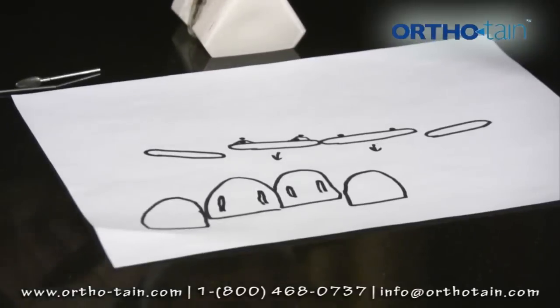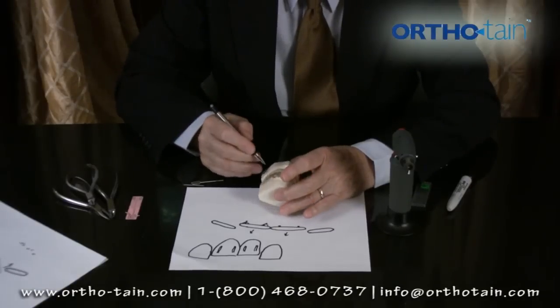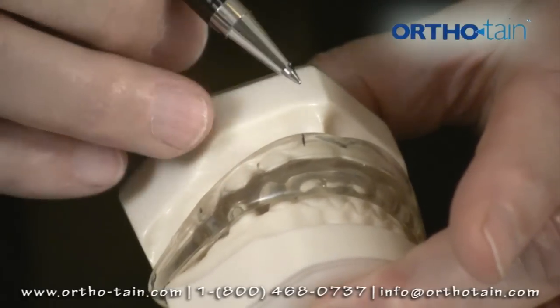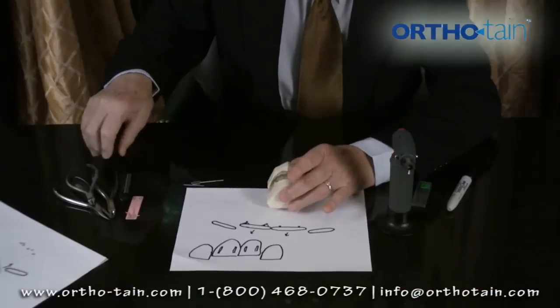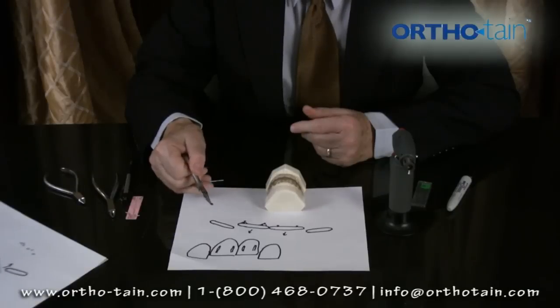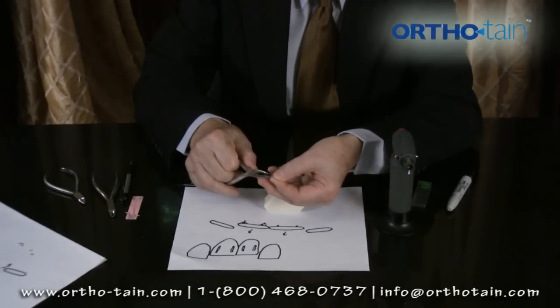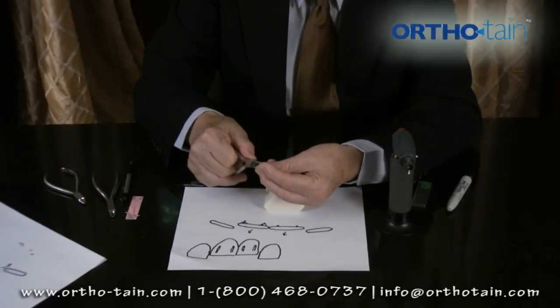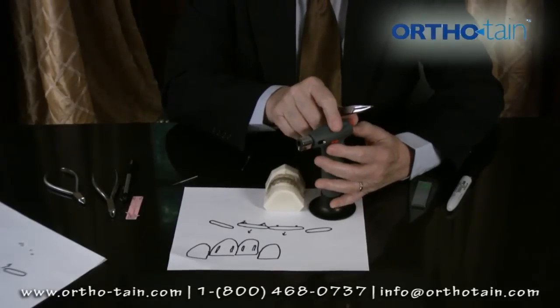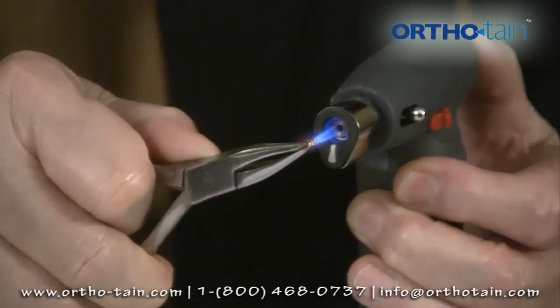If we were to put cleats onto this patient, we would put the appliance in the mouth first. And then if we want to put a cleat, for example, on the central incisor, we would mark with a ballpoint pen where we want to put that cleat. Then we grab the cleat with a serrated plier that you can easily afford to burn up. So we're going to put a labial cleat on this case, and we're going to grab the cleat at the edge and heat that cleat up. We use a little burner with a sharp blue flame.